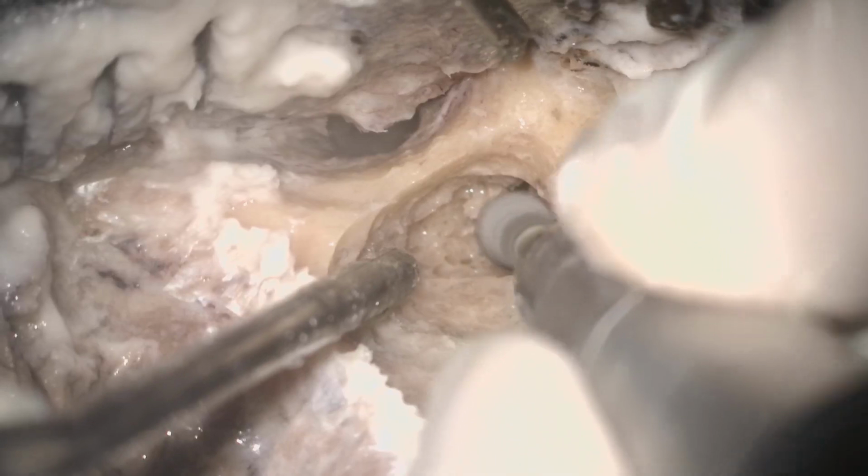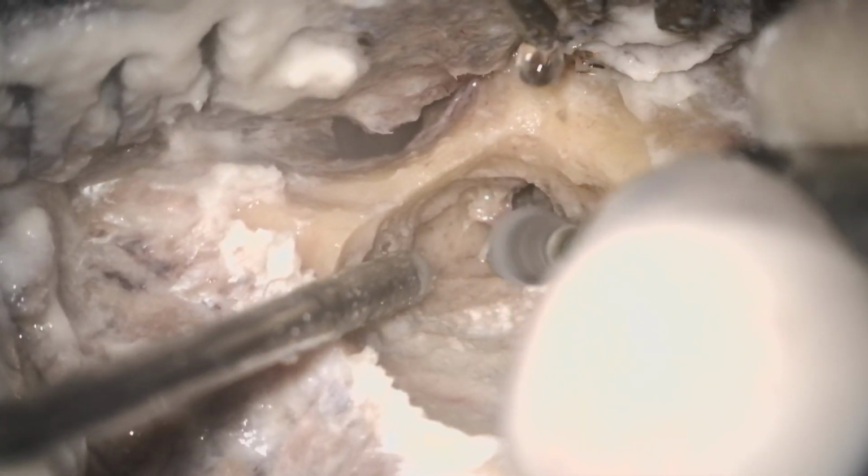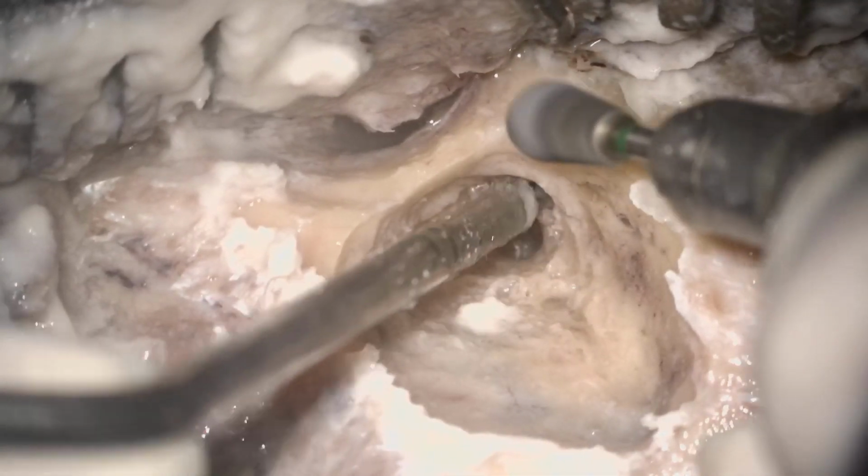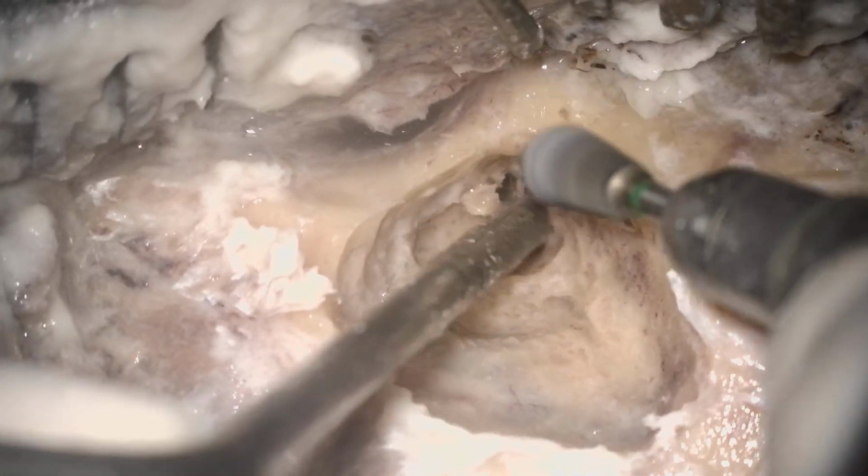So you have to preserve the canal wall properly, so that when you do your reconstruction, when you do your tympanoplasty, it can protect the mastoid cavity from the external canal. So this part is very important.